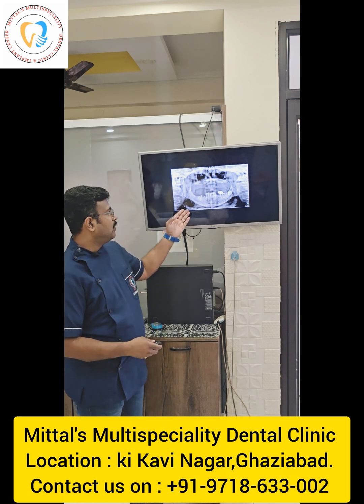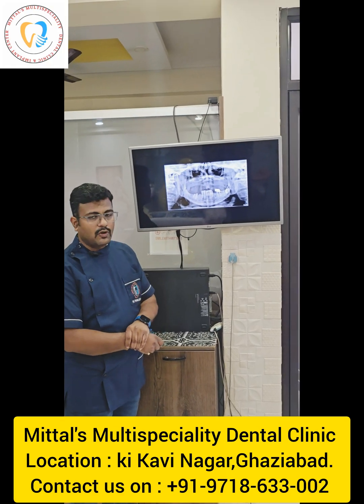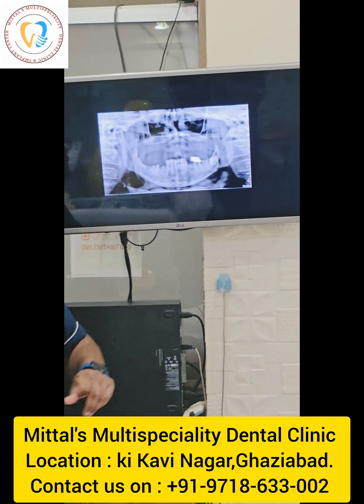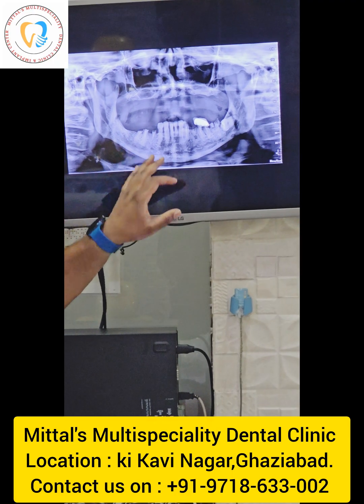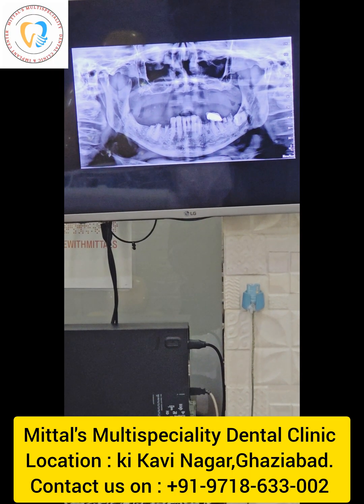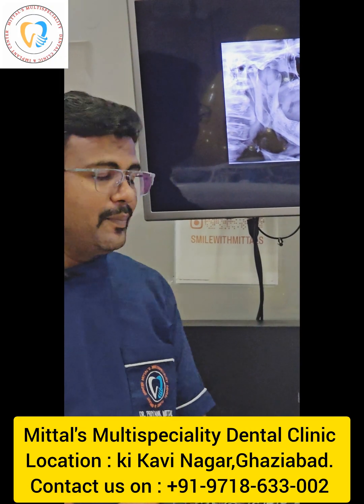So this is the OPG which you can see here. Your maxillary arch is quite resorbed, and you can see pneumatization of the sinuses which is quite approaching the canine area. In the mandible we have posteriors, only root stumps are there with periapical radiolucencies, but the lower anterior area is firm enough and the patient does not want us to touch them.